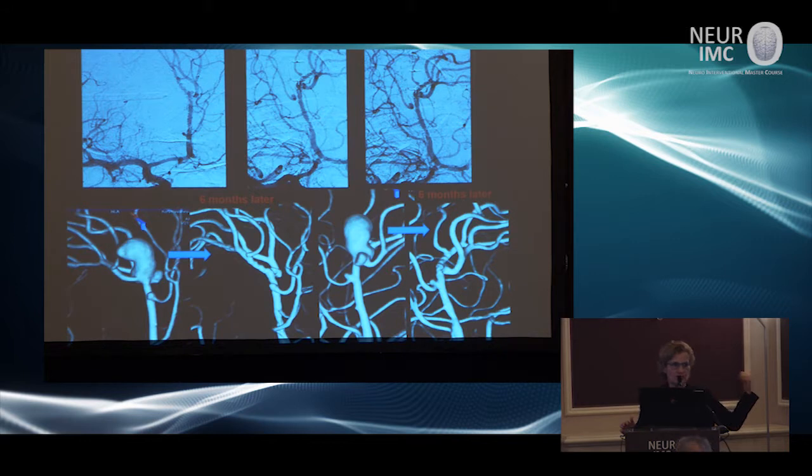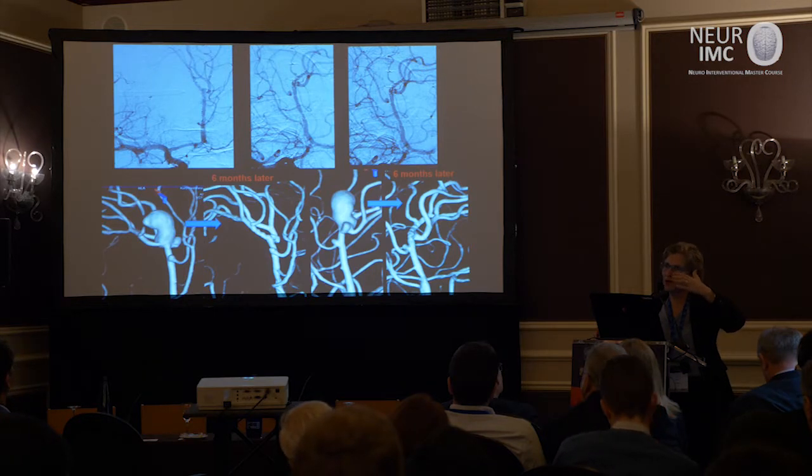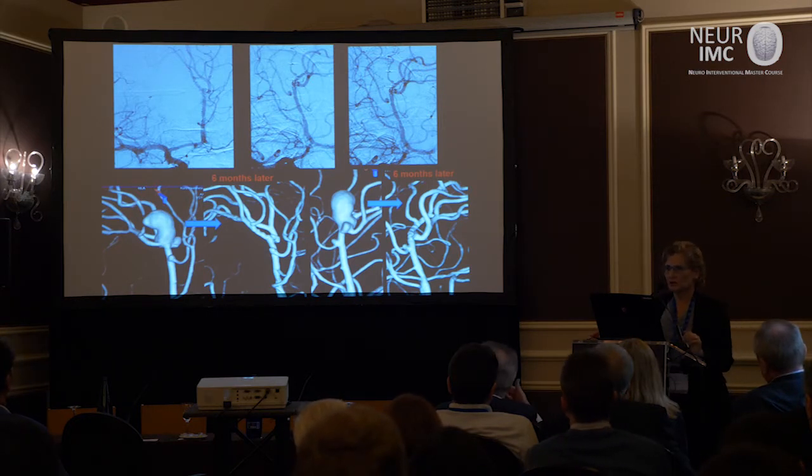In our 100 patient group where we have follow-up over 90%, we have 11% regrowth, I would call it, and we retreated half of them. The other half, we're going to decide what we are going to do, but they were not stable.